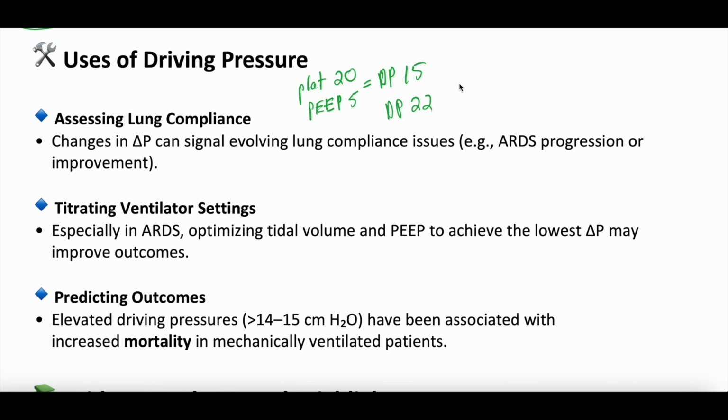What you're essentially saying now is the compliance has changed. Something's going on. Maybe the patient is developing worsening ARDS. Maybe they're having progression of illness because the driving pressure has gone up even though you haven't changed the PEEP. That suggests that the plateau pressure is going up.